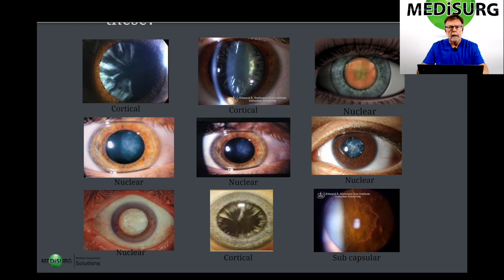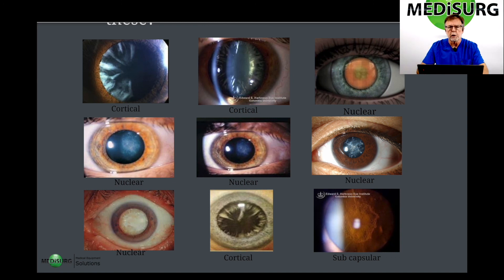In the bottom row, you see a cataract that's white — this has been a very old cataract. They call these either brunescent or white, and they can be either super soupy or very, very hard. In the bottom center is another cortical cataract. And on the bottom right-hand corner, that is a subcapsular — it's very rare. You can see the light coming in from a very steep angle, reflecting off the ridges and bumps on the back surface. If we were to look straight into this eye, we could never tell that it had a subcapsular cataract.